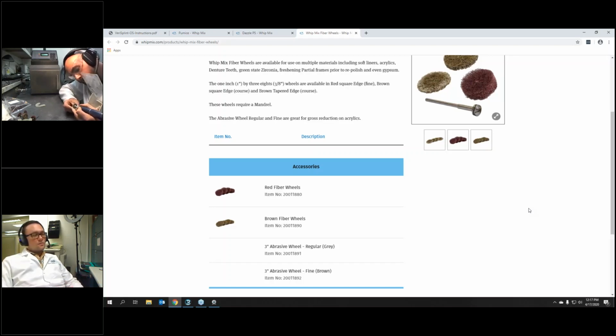The other option is if you are more concerned about the number of supports on that surface and you wanted to have the least amount, then you would want to nest your print more towards that 60-degree angle where you'll get much fewer supports. And maybe, how far along are you on the grinding? Maybe I could pull up Composer over here and show them the difference. Yeah, I mean, I have time.